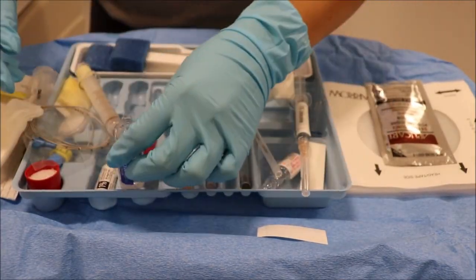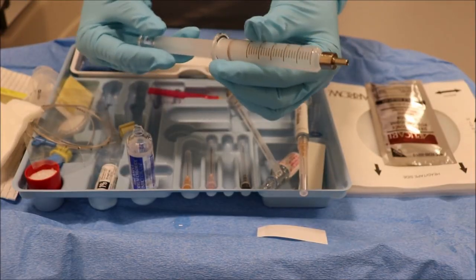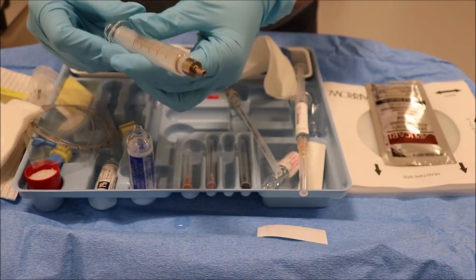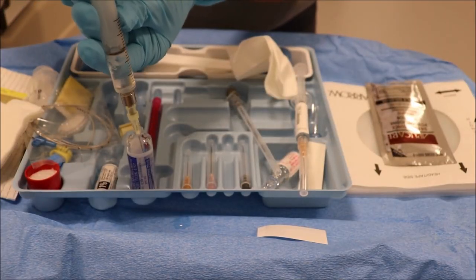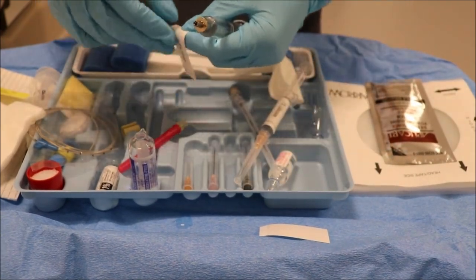Next, draw normal saline into the glass loss of resistance syringe. Before doing so, ensure the glass plunger moves freely and falls under gravity when held upright. Use the straw needle to fill the syringe, then label it appropriately.